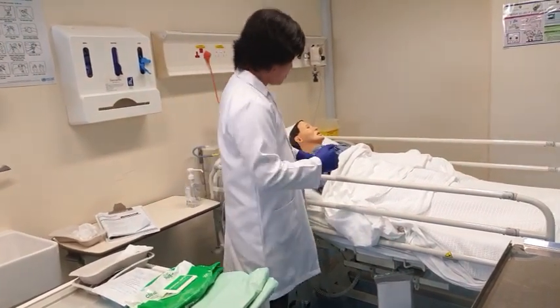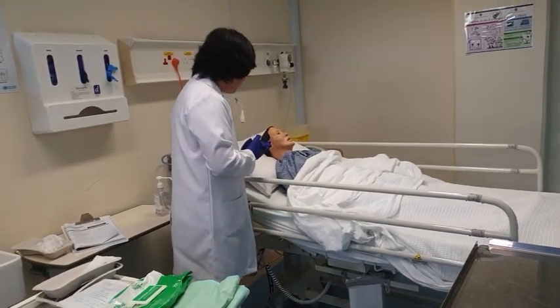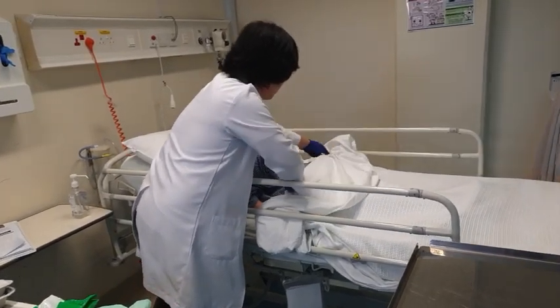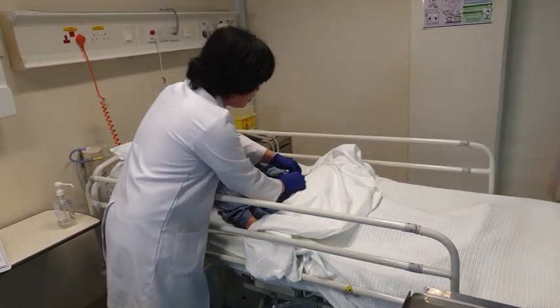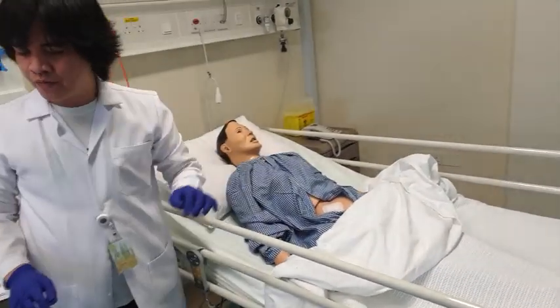Sir, I'm going to start the dressing procedure. Can I expose your abdomen? I will expose the wound, but make sure that the rest of the patient's body is covered. Expose only the wound area.